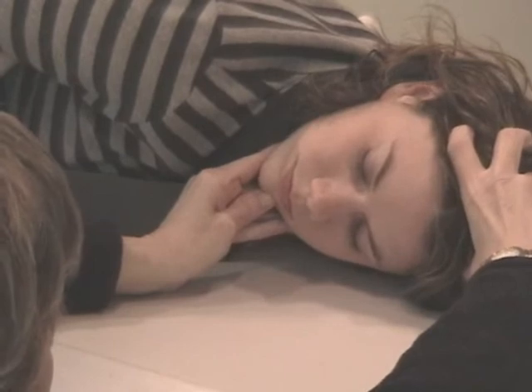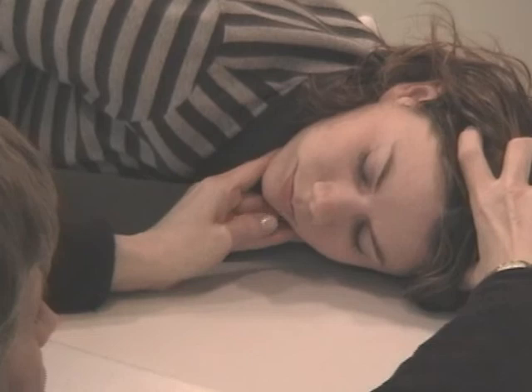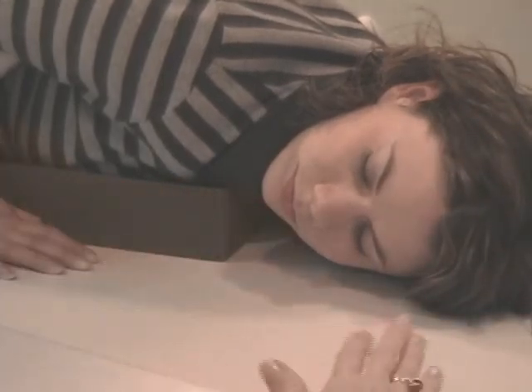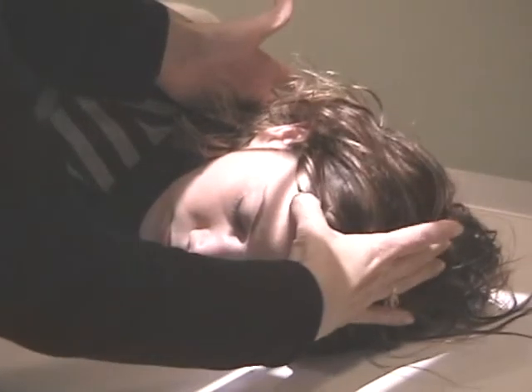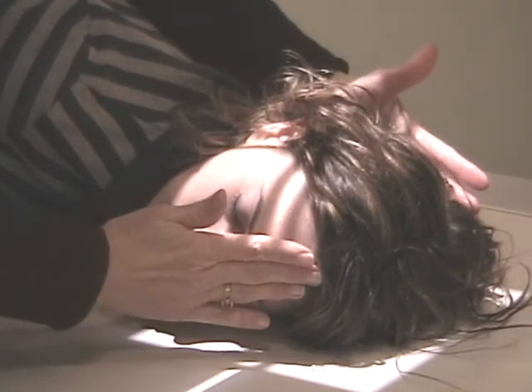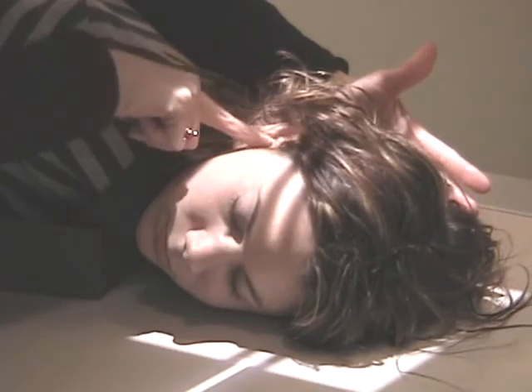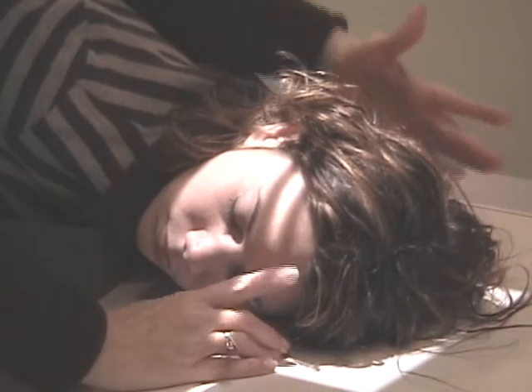And there I'm happy with the lateral position, and then I move quickly because this is not comfortable for her to hold. I might put a sponge underneath her chin if I need to for mobility reasons. I'm finding the top of the skull, the bottom of the skull. I'm centering it this way. Top, bottom, center this crosshair. Back of skull, front of skull. This is basically coming right down the sella turcica, just a little bit in front of the EAM.